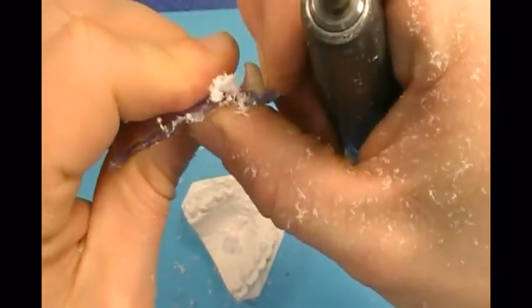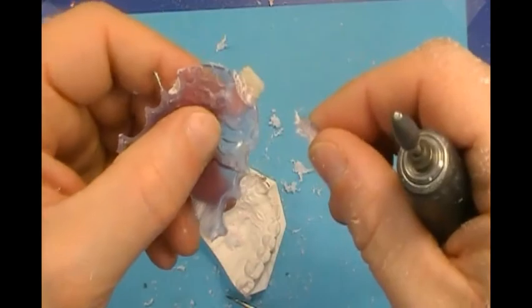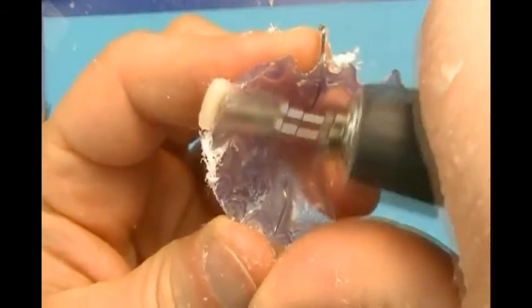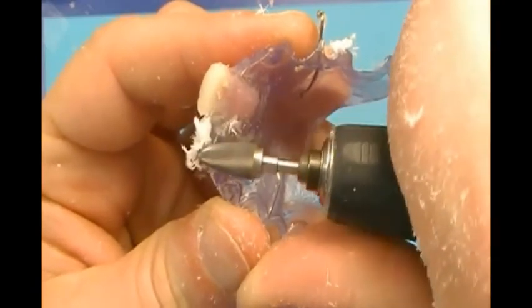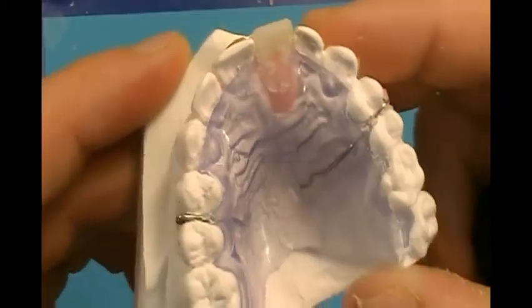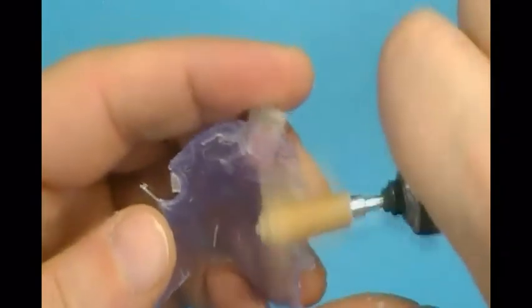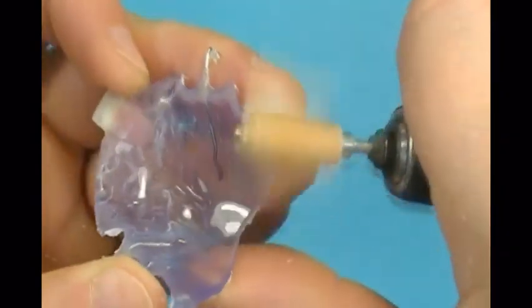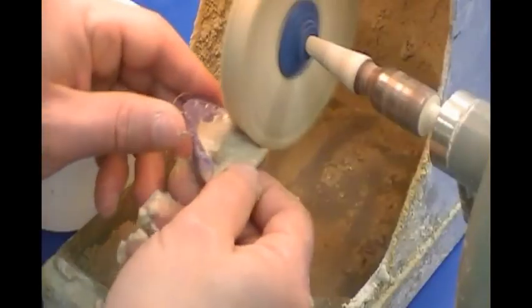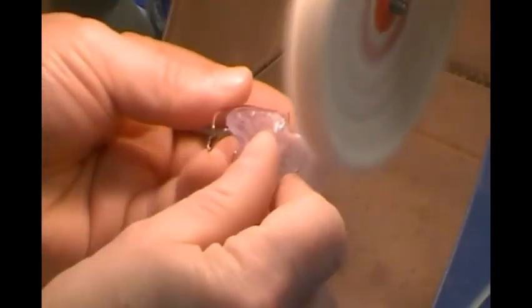Carefully remove the plastic that is over the tooth and level retainer acrylic to the interdental papilla height. Finally, the scalloped posterior and rounded anterior segments are blended into the retainer body. A sandpaper mandrel with a 3-inch strip of 150-grit sandpaper is used with a lab handpiece to smooth trim surfaces at medium handpiece speed. This retainer is pumiced and polished using the same procedures outlined for the upper Hawley retainer. The pontic should be pumiced and polished as well.